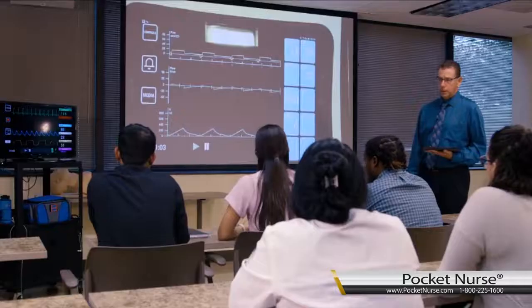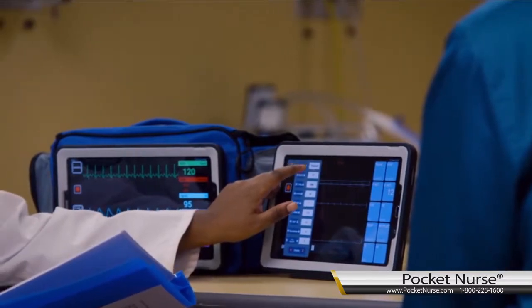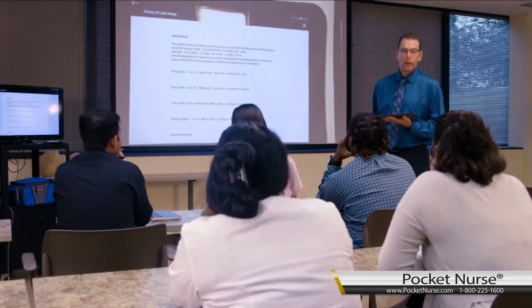Some of the benefits of the VentiSIM scenarios are that you can use this as an educational tool. You can do it in the classroom setting. You can do it in the lab setting. You can do it in small groups, and you can do it in large groups. You can have multiple discussions as you're going through the simulations. You can have the students do a lot of different aspects of taking care of the patient, like interpreting blood gases, calculating compliances, calculating airways resistance.